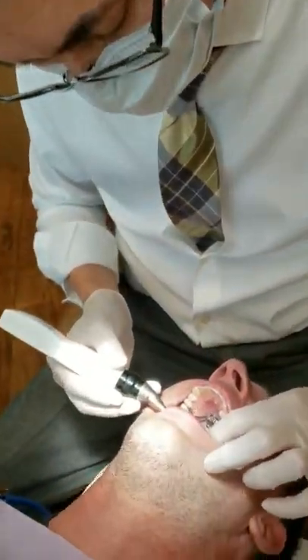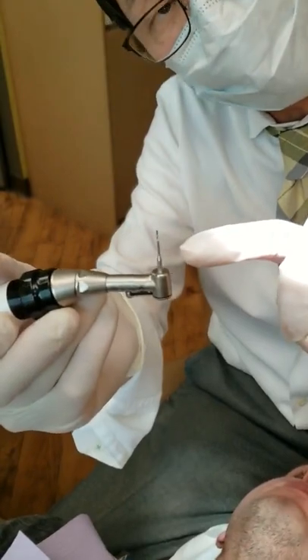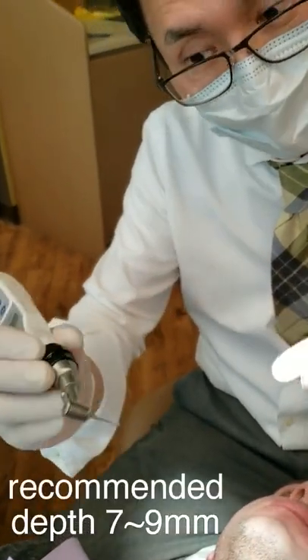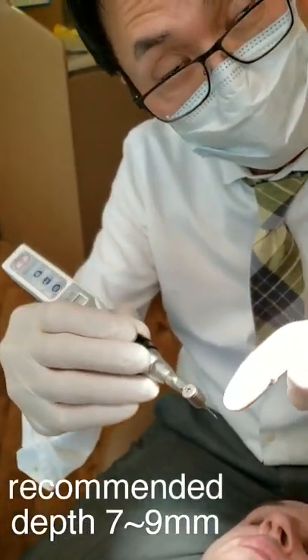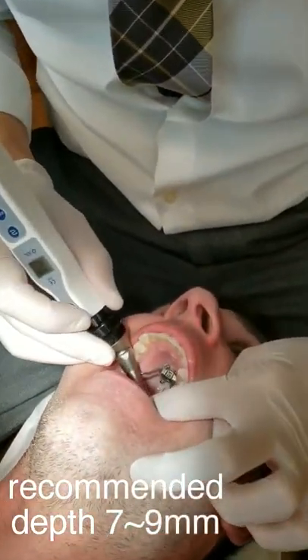Let me try a little first. I'm going to do the posterior. The drill bit itself is probably about 6 to 7 mm. So as long as you sink the whole drill bit in there, you're great. Overdoing it is fine. We're going to do it from the back first.